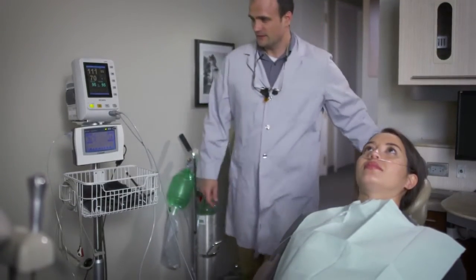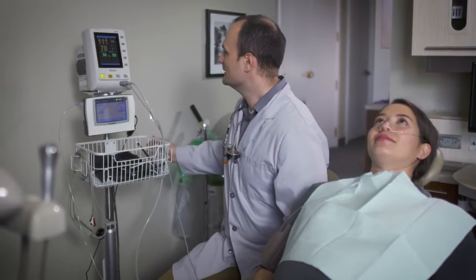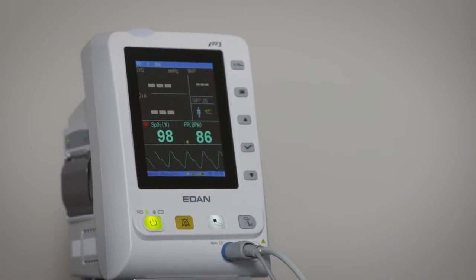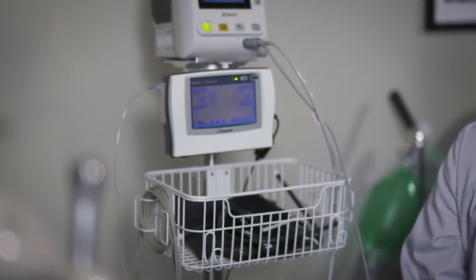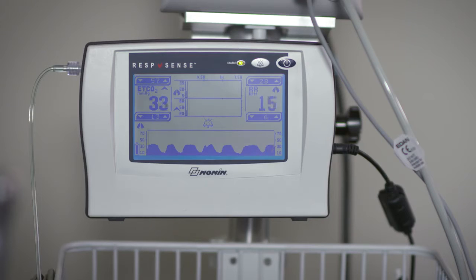The use of sedation during dental treatment has been on the rise over the past several years, especially in my practice, due to a large population who do not seek regular dental care because of the anxiety they feel going to the dentist. The American Dental Association recently revised its guidelines recommending the use of capnography for moderately sedated patients. While this is a new recommendation by the ADA, I have been using capnography in my practice for several years.